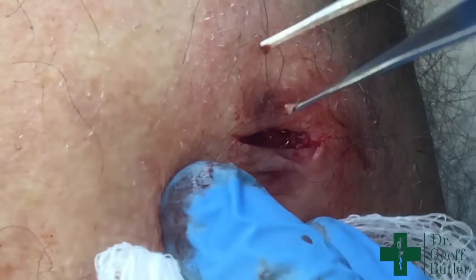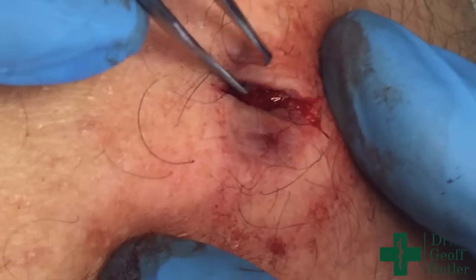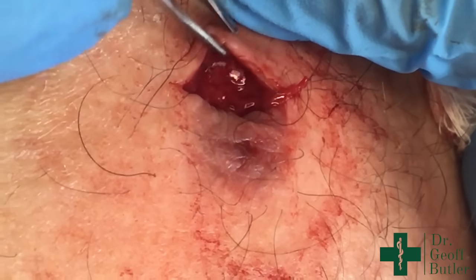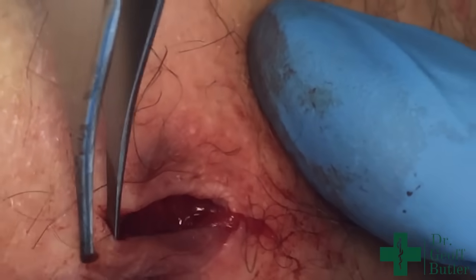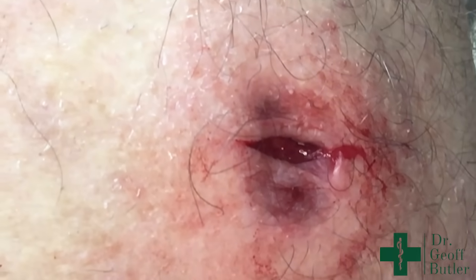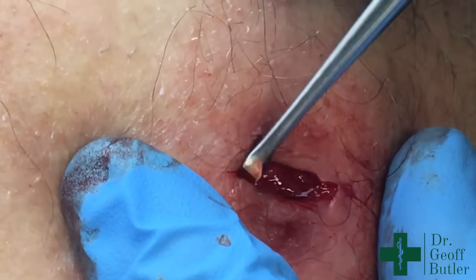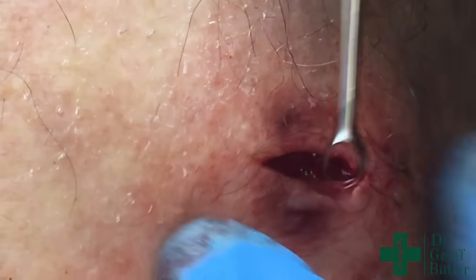I'm going to take another look and try to get a headpiece — I don't know how well it'll show since it's on magnified glasses, but just so you can maybe see in here a little bit better. You can see around there's no actual residual membrane at all — nothing up through there, nothing up through there, so that looks good. As a last step, I'm going to grab a curette — this one's a bit big — and just clean that out a bit. There's nothing there, good.